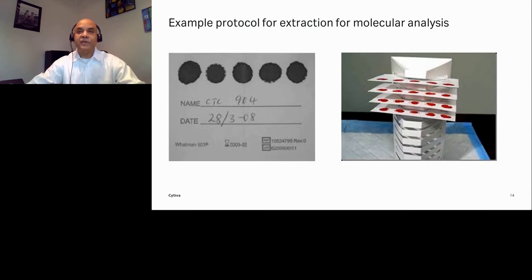There is another, economic advantage. Collection and processing of DBS is considerably cheaper, at least 3 to 5 times cheaper, than samples collected by venipuncture. DBS can be readily shipped in sealed envelopes to reference centers, whereas sera need to be packed in break-proof containers. Transport of frozen sera may require the use of dry ice or liquid nitrogen, requiring further specialized handling and adding considerable weight to the item.